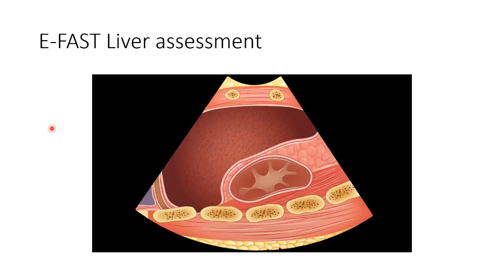We're going to image a little more inferior here, and we're also looking for the liver, the kidney, Morrison's pouch, and here we're looking at the mid and inferior portion of Morrison's pouch that we cannot see because of the size of the liver. In order to get a clearer view of the diaphragm, we will see the spinal stripe here as our hard landmark. We do see part of the diaphragm, but we don't see above it as well.